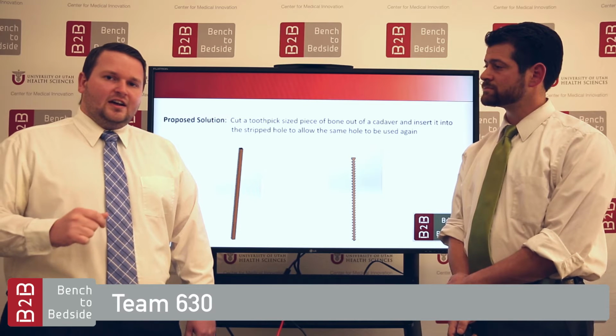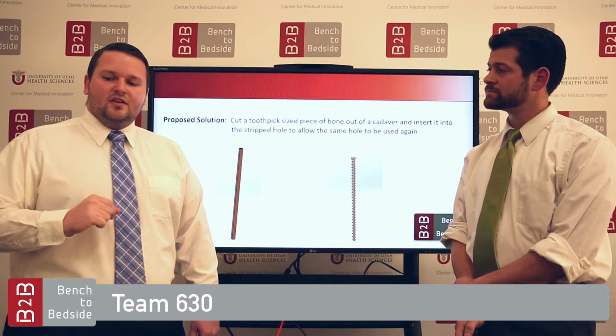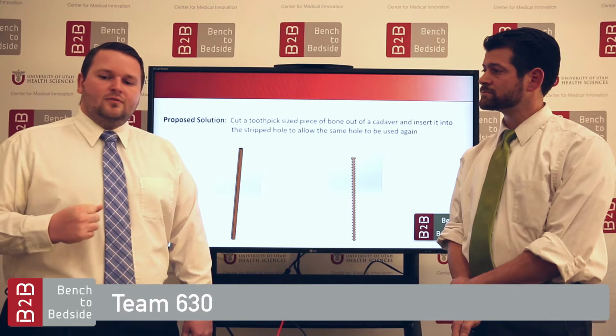And the second one is a little bit more complicated. On the left-hand side, there are little tines that will interact with the tines on the screw. And on the other side, there are jagged edges, which will interact with the outside of the hole in the bone, providing additional friction for pull-out.